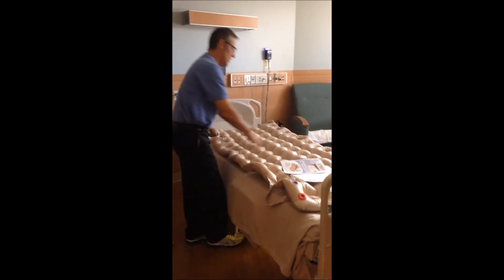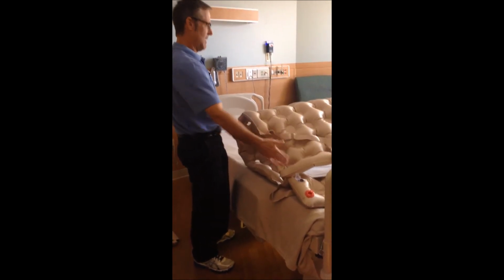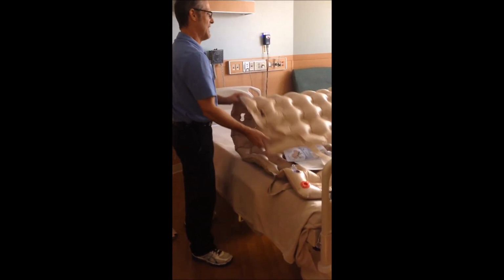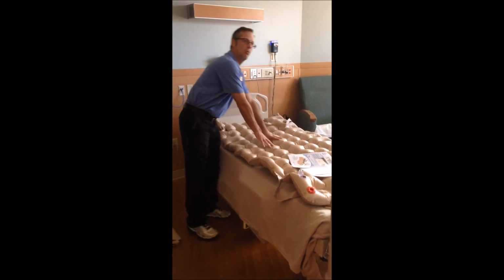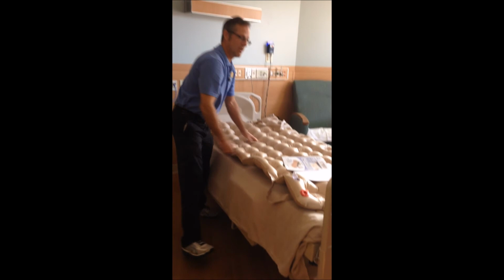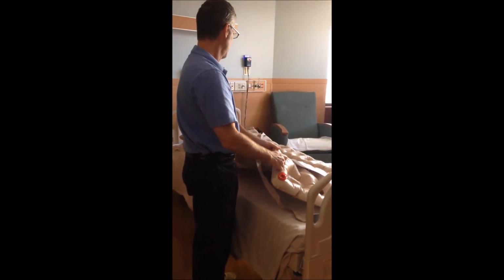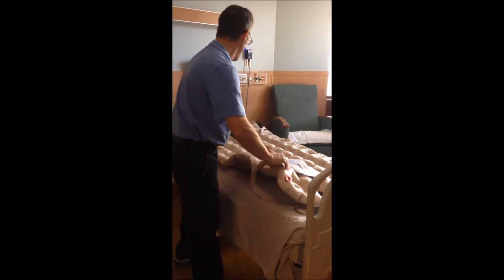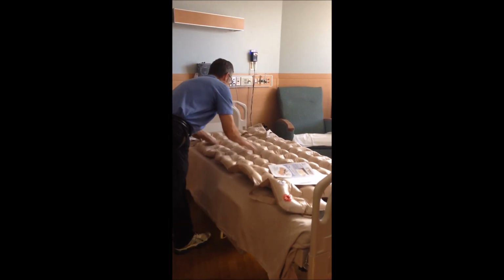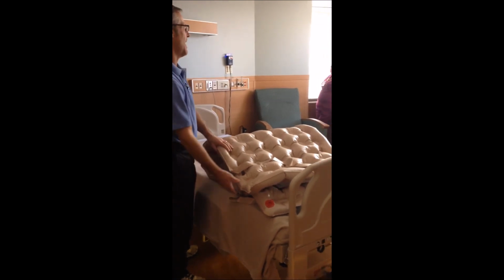Hear how hard that is? The air's not moving. We fold it in half. It's got that big loop. It won't even fold in half. That's too much air. This will actually create pressure if you have it overinflated like this. So once again, what you would do is take this clear valve, let a little bit of air out, and do a hand check, or if a patient's on it, do a hand check, move it around, or fold it in half. That's what it should look like.